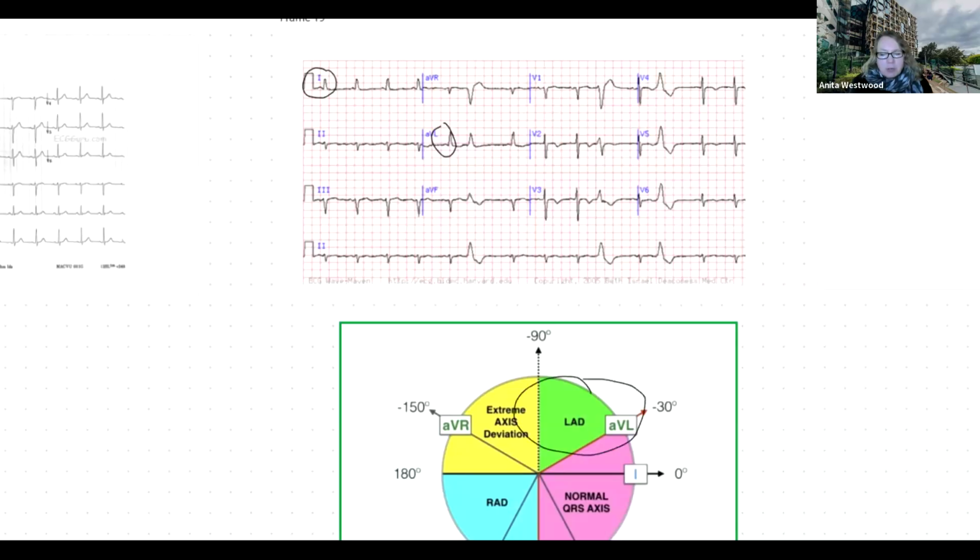So systemic hypertension, aortic stenosis, anything that's affecting that left ventricle, bundle branch blocks, for instance, inferior MIs. Yes, we can check more than that. Usually it's the corresponding opposite lead, so an inferior and a lateral lead will do it. Depends on what reference scheme you use. People do it different ways, but usually it's those opposites. If I've got a positive in lead 1, a lateral lead, and I'd also look at AVL because that's also a lateral lead, that is also positive. And I've got a negative in all my inferior leads.